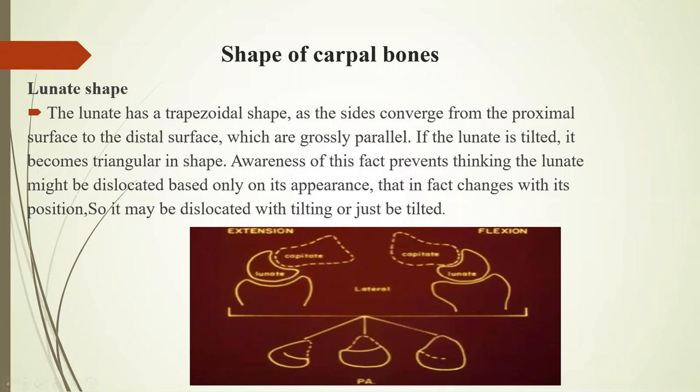Now on the PA view it is trapezoidal, and triangular approximately in shape when tilted.